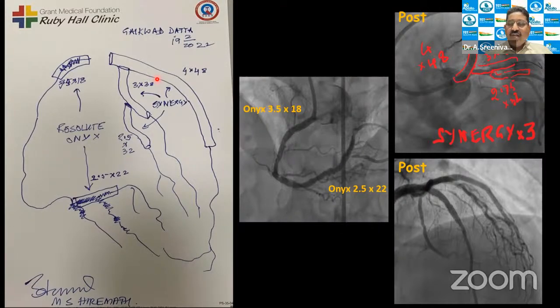That's why you took it, in spite of it not being PDA, into distal RCA, because that had a lesion. And the size of the vessel also matters. That's how you finally could achieve a good result. And if the final perfusion flow is good, then I think we can still go to the other vessel. But after doing the RCA, if there's some slow flow or some problem there, then that's where we tend to wait and see how the patient behaves before we go on to the other vessels. But here, I think the final outcome, you're satisfied.